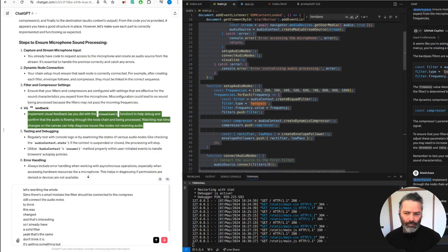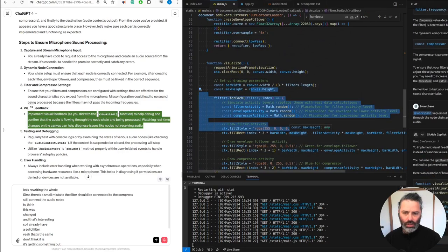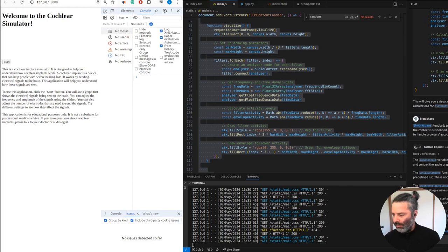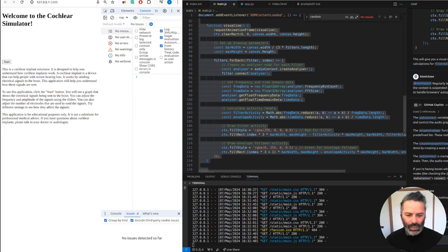slowly or something. Okay, we have a visualize function. That's not just a random thing. Okay, this tool might be taking quite a few sessions, which is fine. And nothing is being displayed. Microphones seem to be connected okay, but I don't see any envelopes or the sound amplitude. Should be fairly simple. Get stuck.